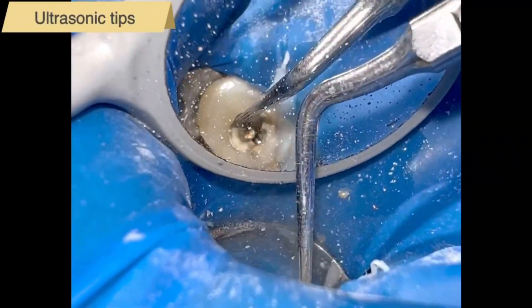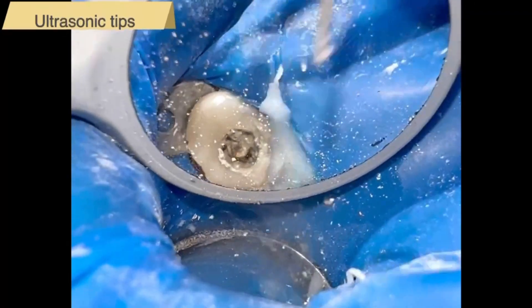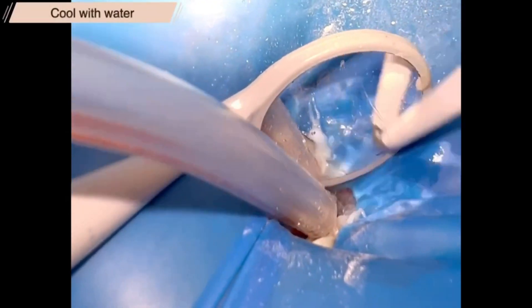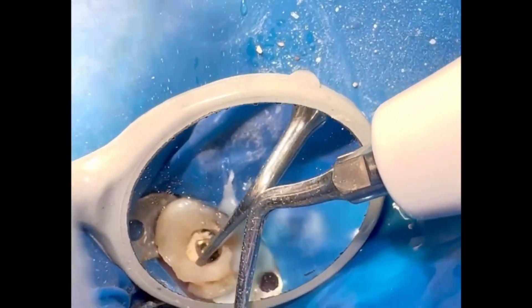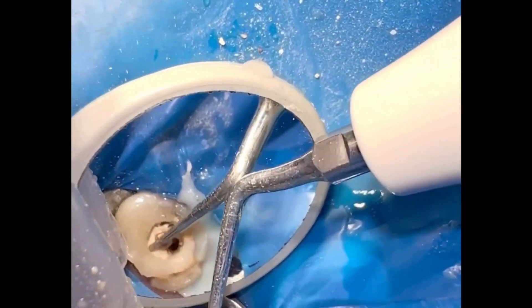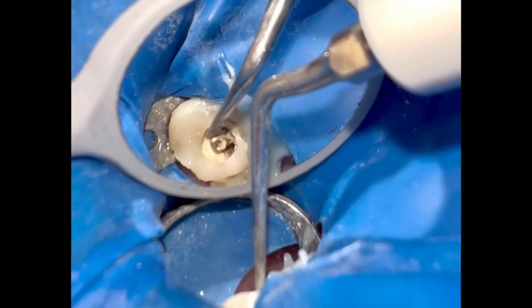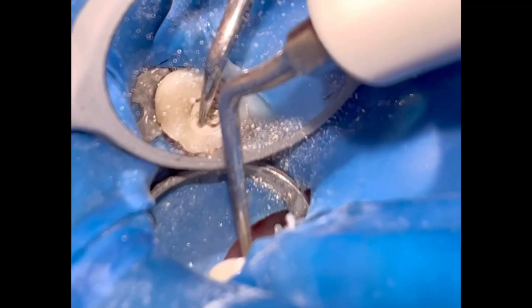We remove cement around the post with ultrasonic tips. It is important to cool the post with water or hypochlorite due to the overheating produced by ultrasonic vibration. Do not use ultrasound for more than 15 seconds due to overheating of the post and dentin, and thus we will avoid damage to the periodontal ligament.